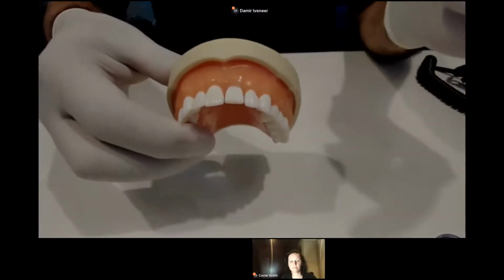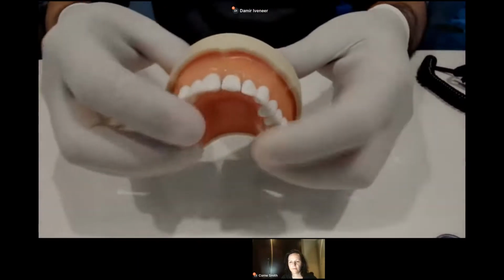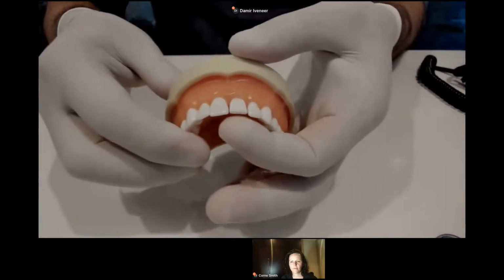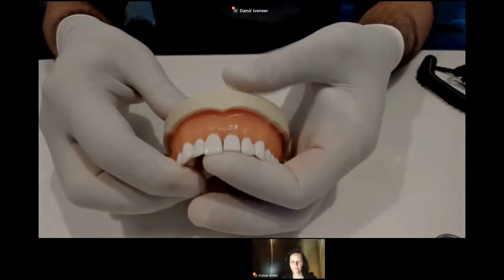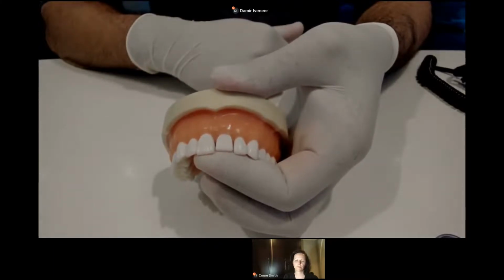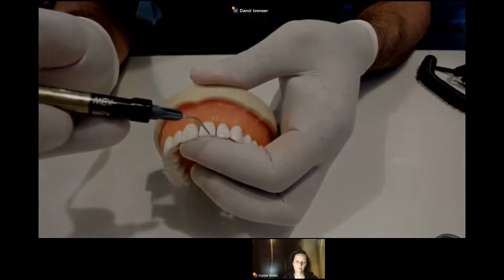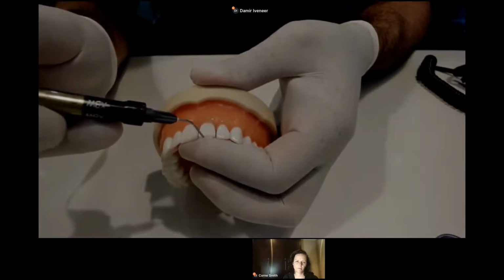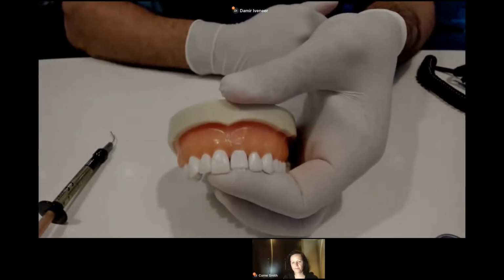Yes. So I take my finger, as you see now, the incisal area of tooth number 21 is shorter, okay? For the purpose of the demonstration, I did it, of course. I can put my finger from behind, and once I put my finger from behind, I touch the other two teeth, and in this way, I know that this is the correct palatal shell shape, okay? And then I can take the flowable composite and I can draw the palatal shell without touching the other teeth. I can see that I don't touch the other teeth, okay?